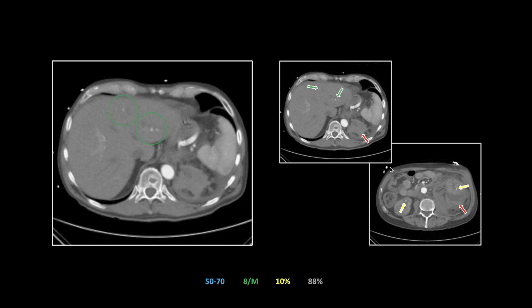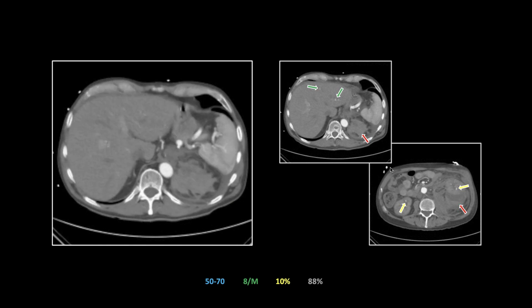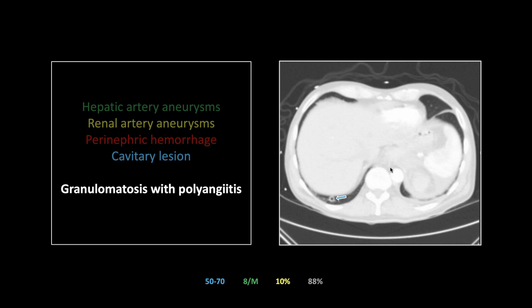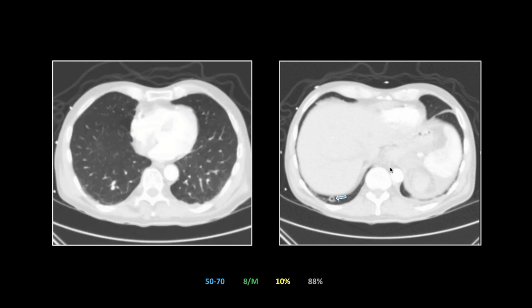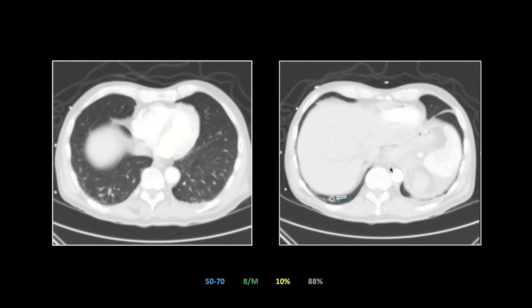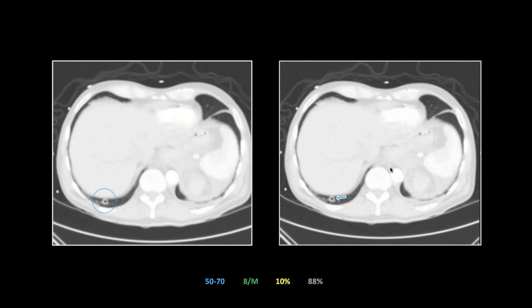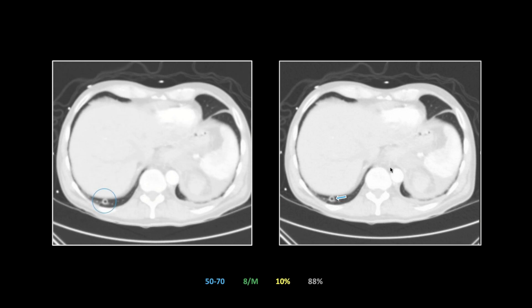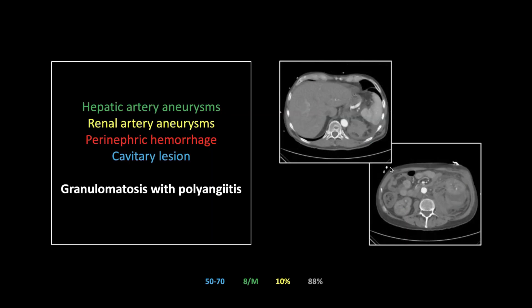Renal aneurysms can be associated with other things — IVDU, other vasculitides. The liver involvement is a bit unusual, but what seals the deal is a tiny cavitary lesion in the lowest portion of the visualized lung. A cavitary lesion combined with evidence of angiitis — that's going to be a case of Wegener's granulomatosis with polyangiitis.